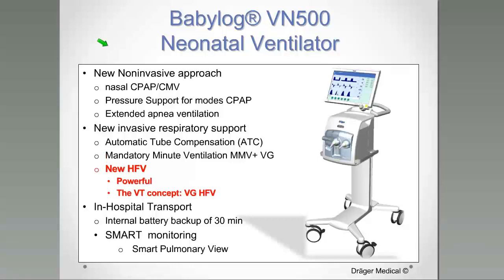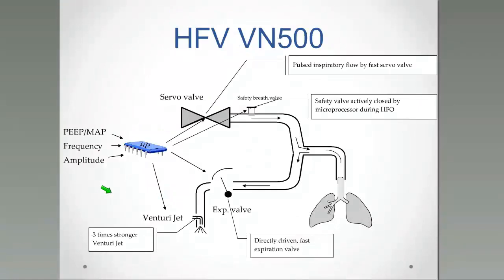Right now we have a very powerful ventilator. Because of this, we can transmit the energy of the delta P of the small tidal volumes even to big lungs, even to lungs with some kind of obstruction. But the most exciting thing for me is that we have the possibility of using a continuous tidal volume guarantee. So we can set a certain tidal volume and the ventilator is going to increase or decrease delta P to keep this tidal volume continuously at the same level. And this is important many times because we can prevent changes in the arterial PCO2.